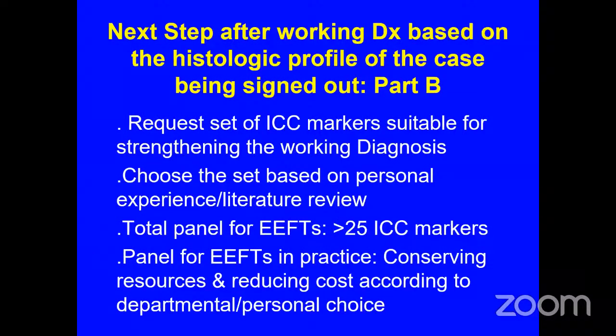So you have a working histologic diagnosis. So the next step is to request the set of IHC markers which are suitable for strengthening your working diagnosis. And when you do that, and if your diagnosis is strengthened, then you take the next step of requesting the genetic marker.